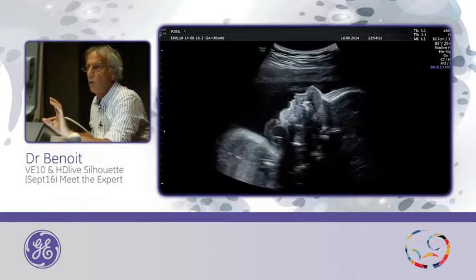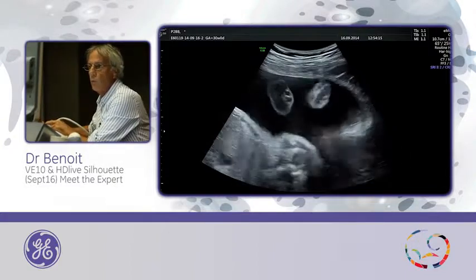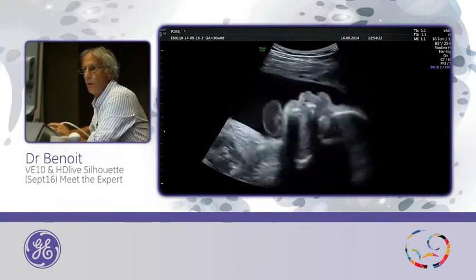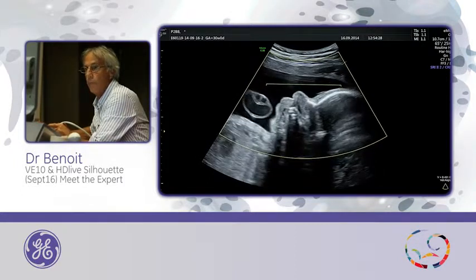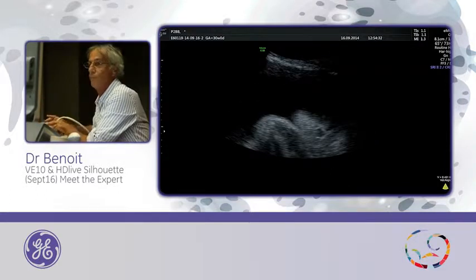And when I do, if you want to do a nice 3D, if you want to acquire a good volume, you always have to work with your two hands, because when you work with your two hands, you can push the head and you can move the baby. But if you do this, you need a foot switch. And I always work with a foot switch. Start.